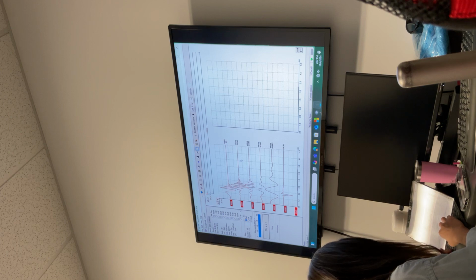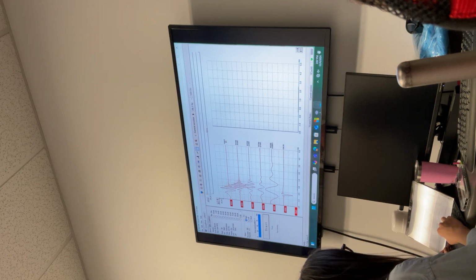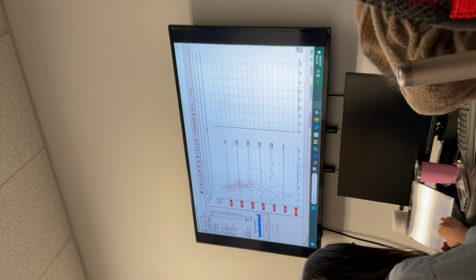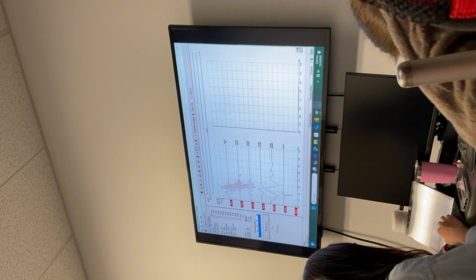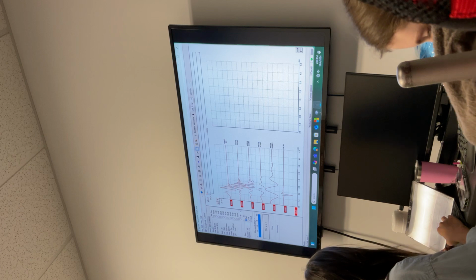So when the 4,000 hertz narrowband CE chirp is played, 2,700 is presented earlier, then the peak energy is around 4,000 hertz, then this is like 5,600. So within that narrowband CE chirp, there is traveling wave compensation going on. Okay, the broadband is across the broadband frequency, like say 2,000 hertz.